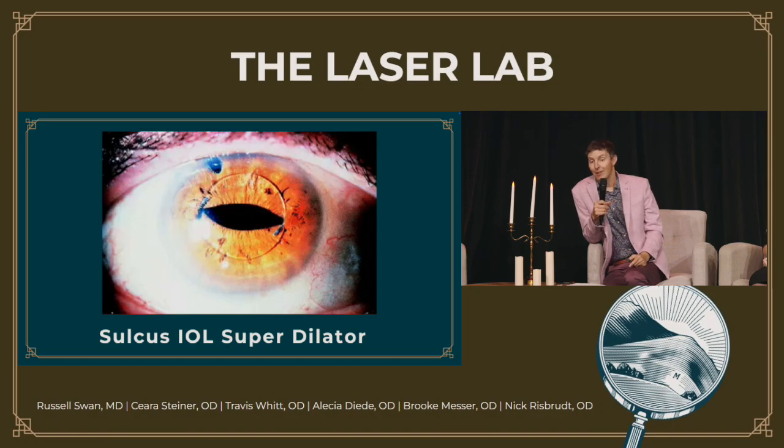Rarely, and I've actually never seen this clinically, but I have an associate, a friend of mine, who did have this happen once, where they dilated a patient who had a sulcus-based IOL that was not optic captured. The patient dilated well, they did the YAG, the dilation wore off, and the optic got captured anterior to the iris, which is a bummer. And that has to be surgically corrected.